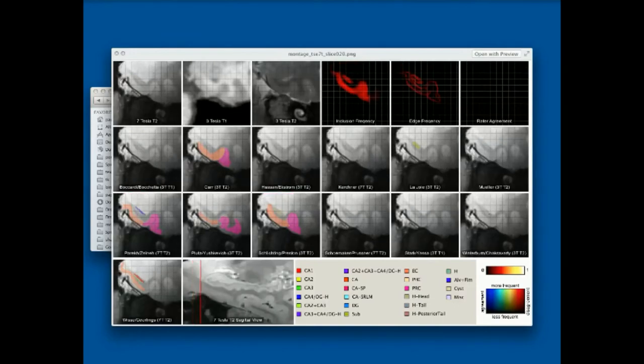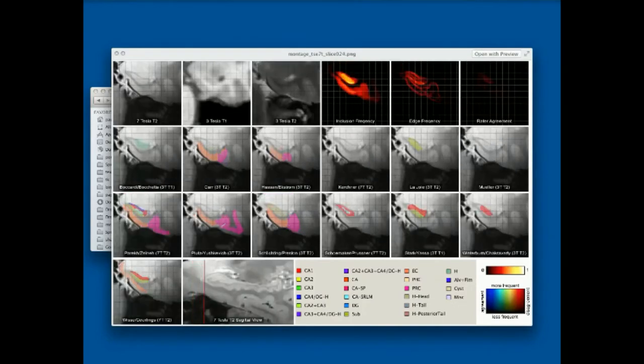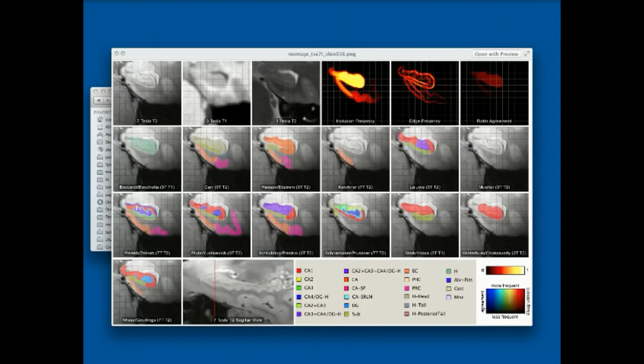Okay, so I'm just tempted to back up what Sandy says. We had a meeting not so long ago where, I'm obsessed with these hippocampal subfields. We had 13 different groups who had different segmentation protocols for hippocampal subfields. They all segmented the same image with their own protocol. You can see the protocols are very different. And my job was to put together some kind of quantitative analysis and generate some figures. All of this stuff was generated using C3D pretty much.